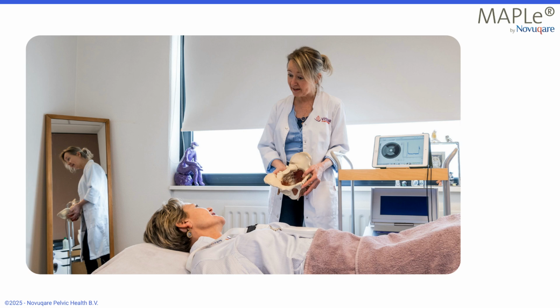Patient-centered approach. Always keep the patient at the center of treatment. Do not focus solely on iPad settings, but also observe breathing and possible compensations, such as tension in the gluteal muscles.